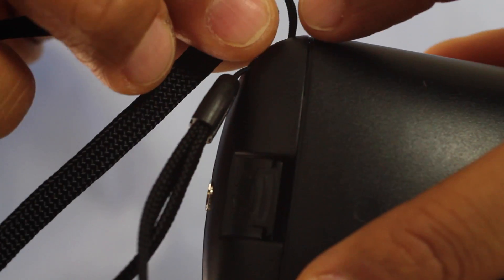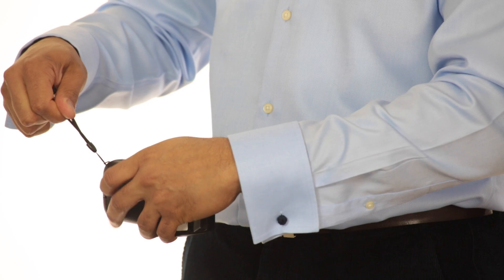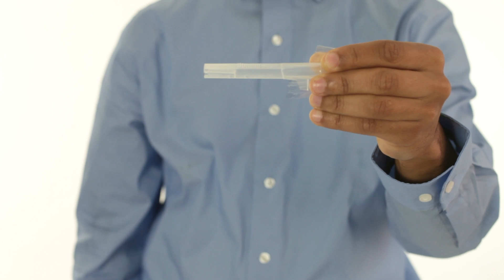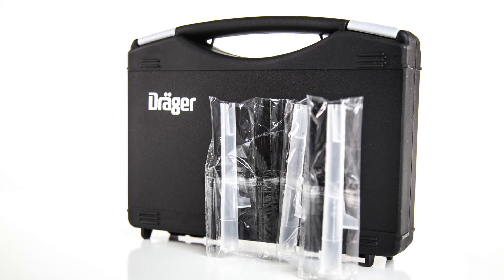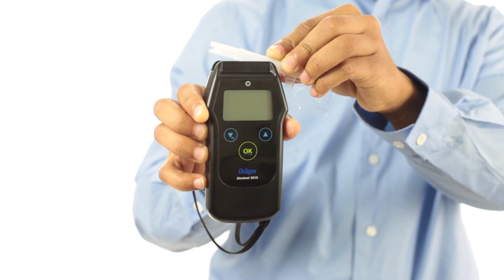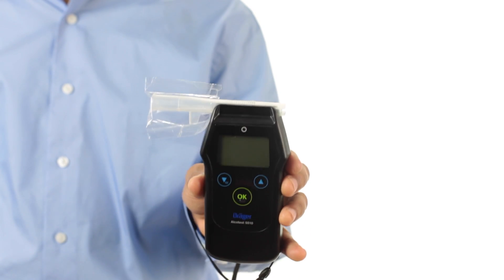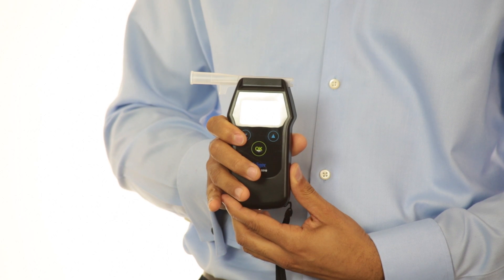To attach the wrist strap, insert the small eyelet into the hole at the bottom right corner of the device, thread the longer loop through the eyelet and pull it through until it extends over the plastic covering. A mouthpiece must be attached before testing unless you are using the device in passive sampling mode. To attach the mouthpiece, open the plastic packaging along the perforation and slide the packaging off the smaller squared end of the mouthpiece, leaving the larger rounded end covered by the packaging. Keep the mouthpiece covered by the plastic until just before administering a breath test. Slide the mouthpiece upward until the ejection tab contacts the edge of the device, then push it down into the channel and snap it into place. The mouthpiece can be attached from either the right or left side. Make sure the mouthpiece is attached properly, as incorrect attachment can cause the receptacle to wear down or break. Remove the packaging from the large end before performing a breath test.